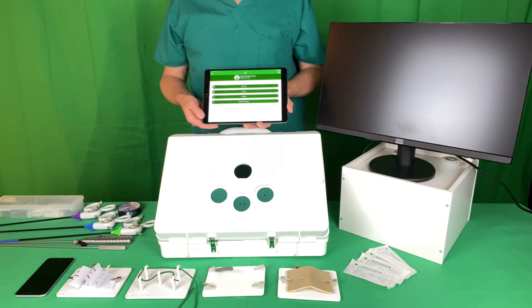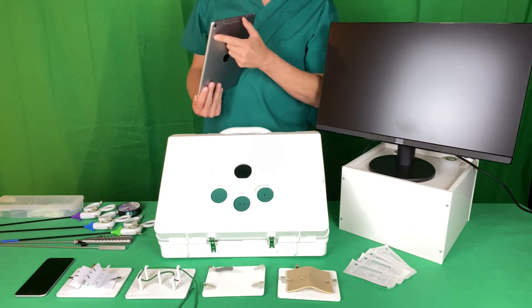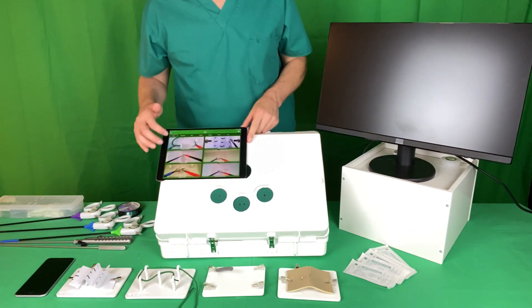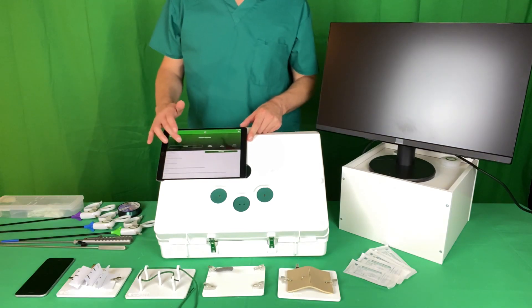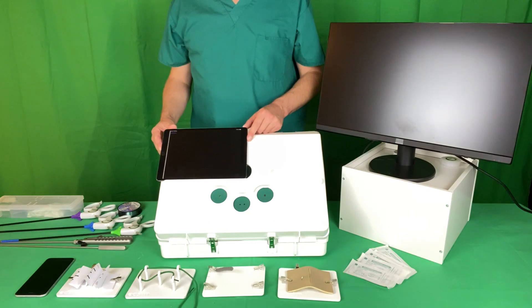Open up the SurgeTrac application and point the camera of your device — phone or tablet — through the aperture at the lid, and then what's going on inside the box is portrayed on the screen.